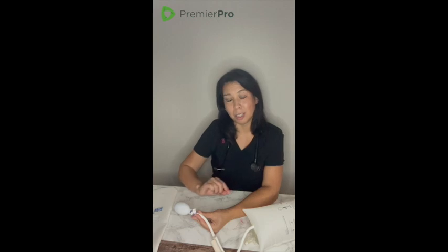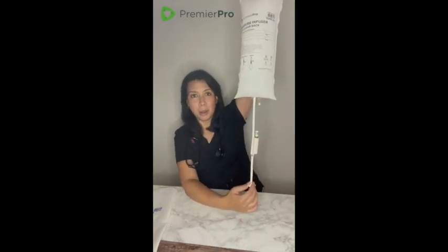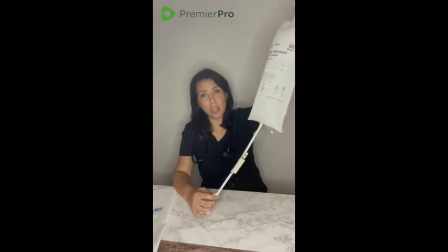Now, I have one last critical step to perform. Just like when we started, we made sure that our stopcock was in the inflate position. Now we need to turn it to the maintain pressure position. I'm going to do that simply by rotating the tail 90 degrees so it's pointing straight up, right towards the IV bag. All right, that's it. I know my bag is inflated to the proper pressure, and it's going to hold that pressure for as long as I need.